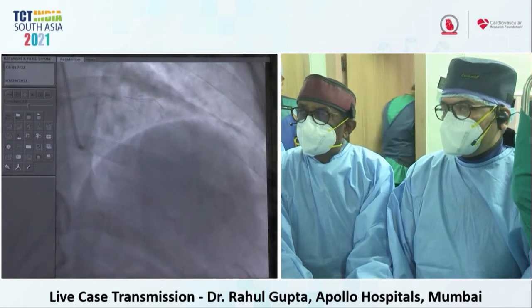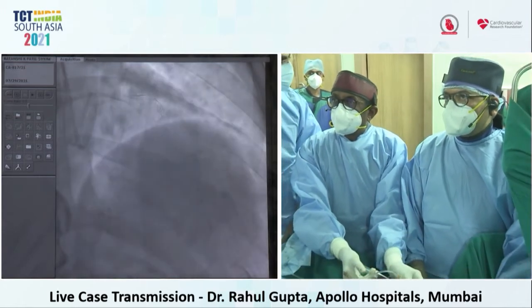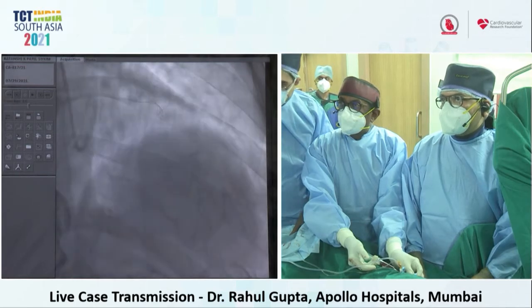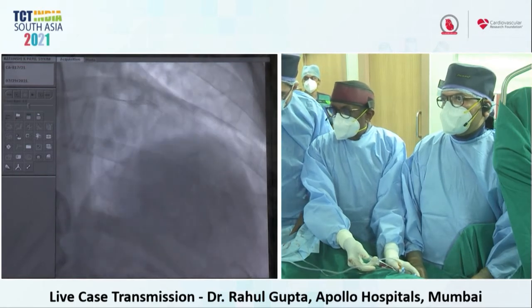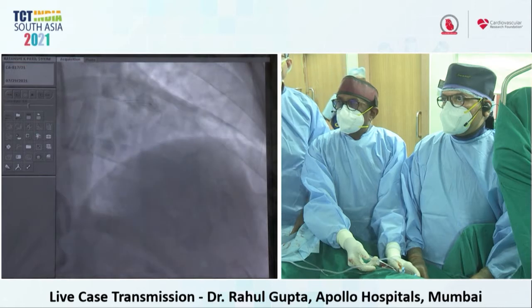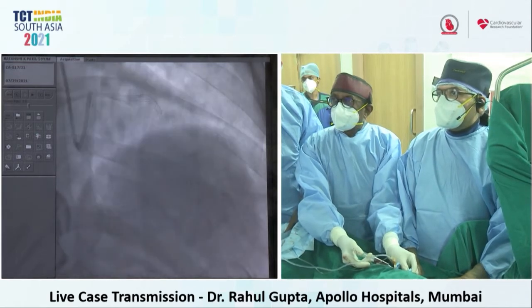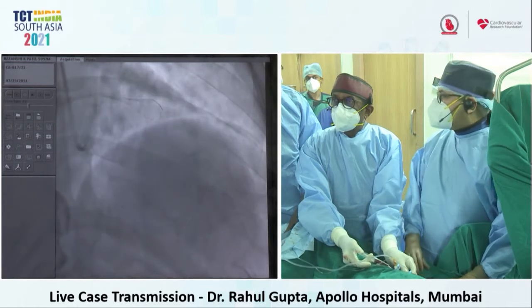Yes. I think with this, if no further comments or questions on this particular system, I actually have two comments here. One is that Dr. Sanjay sir mentioned about the radial artery size. Dr. Ferenc is one of the oldest operators. Now he has described some distal radial technique also. We'll take a balloon. Please go ahead, Sanjay.